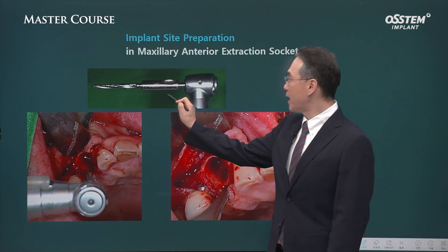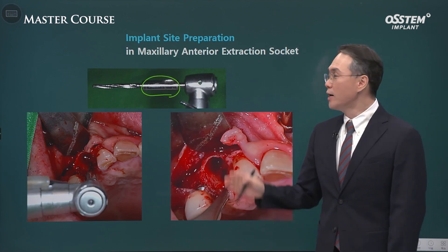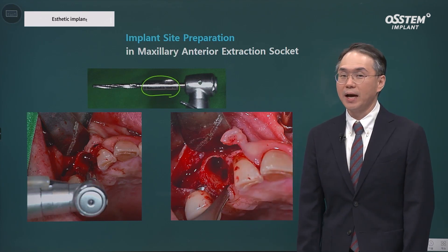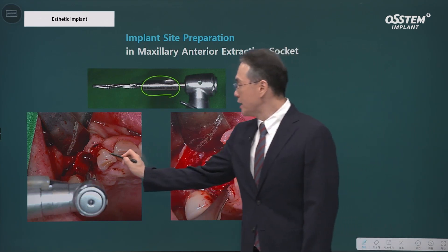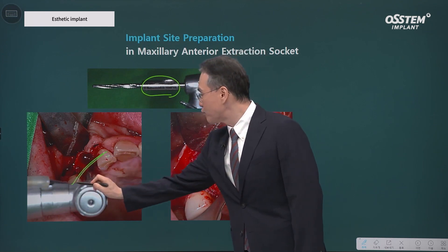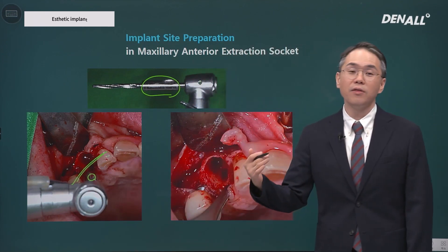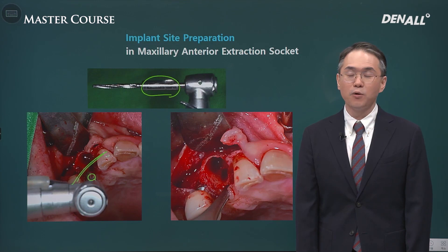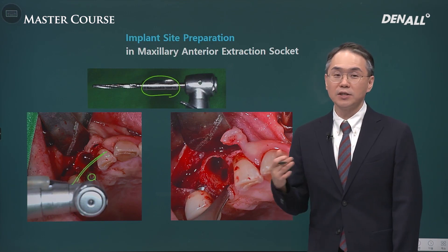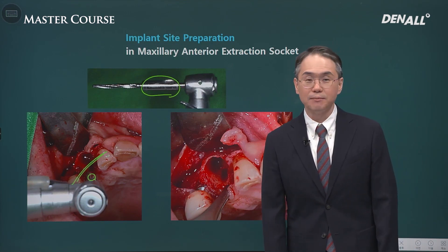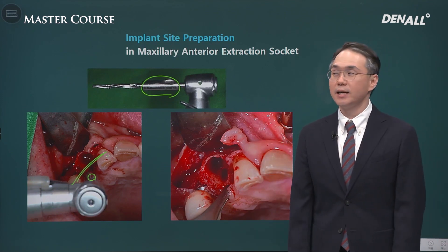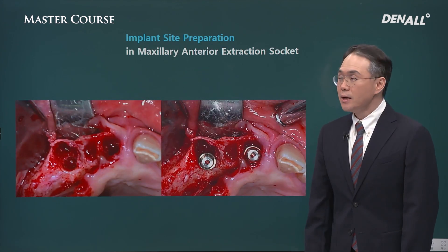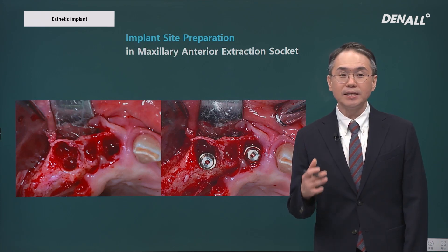I'd like to give you a very simple clinical tip: use a drill extension. By doing this, when you use a side-cutting drill or tapered drill, you can evaluate the angulation of the drill. I make a virtual line which connects the labial surface of adjacent teeth, and if the drill extension is positioned more palatally based on this virtual line, then you can make a nice indentation on the palatal wall as we continue drilling. This will lead to favorably placed implants. When you do drilling in the upper anterior extraction socket, it is better to use drill extensions for all drills.